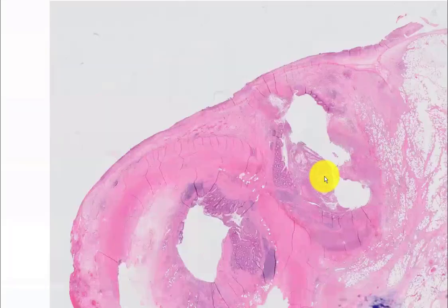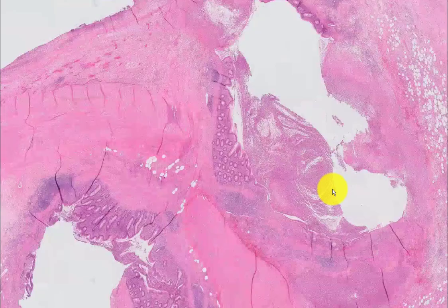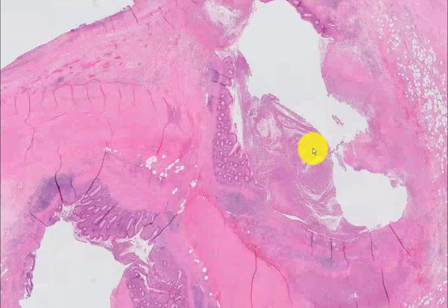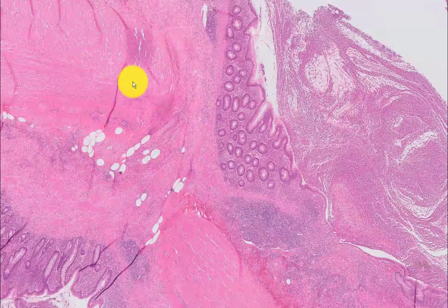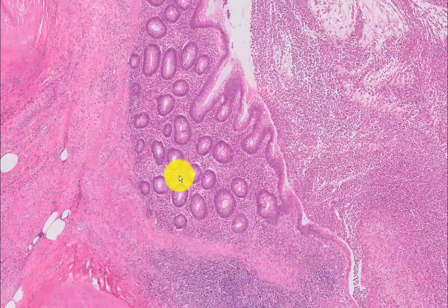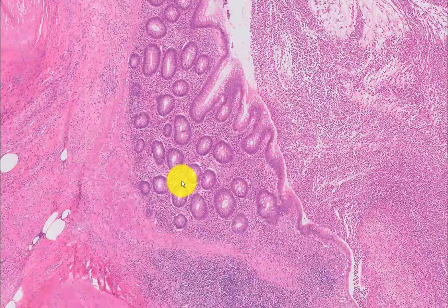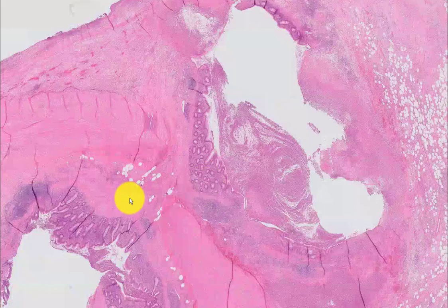What we're truly interested in is what's going on here, because there seems to be a double-barrel appendix. Here's one lumen, here's another lumen. Notice what's happening here — there's a rent in the muscularis propria right there. And if you look at this, this looks exactly like the mucosal lining of the appendix. Here's a rent, and here is mucosal lining.